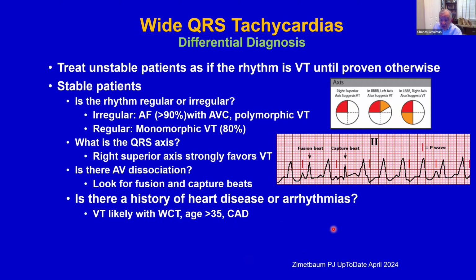So in ventricular tachycardia, when the impulse comes from the sinus node and gets to the AV node, because of the more rapid ventricular rate, the AV node is refractory, unless it lands at just exactly the right time, like this, in which case it will conduct and cause a narrow complex beat, which is called a capture beat, in the presence of a wide complex tachycardia.